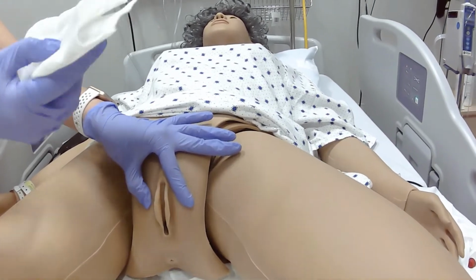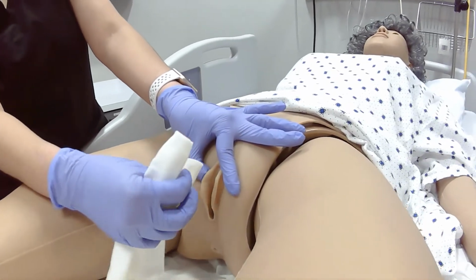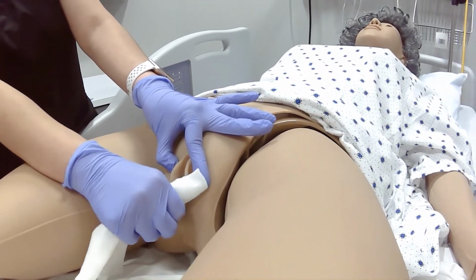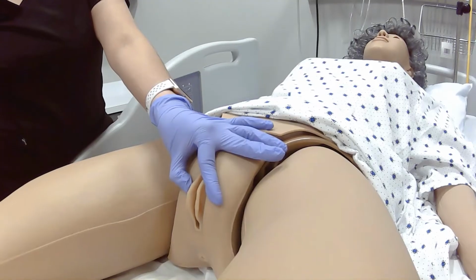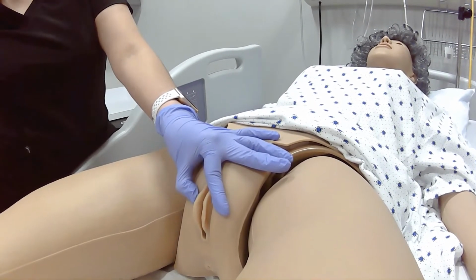And then I'm going to get a new wipe. Now we're going to clean proximal, so the side closest to me. Top to bottom, one wipe, first wipe, and then throw that away, get a new wipe. Now I'm going to clean the middle, okay, the medial.